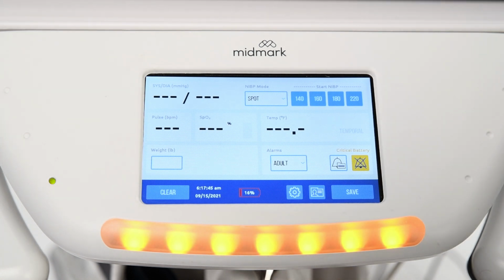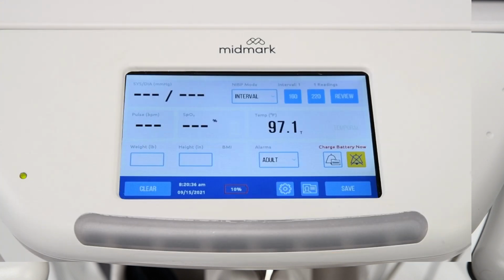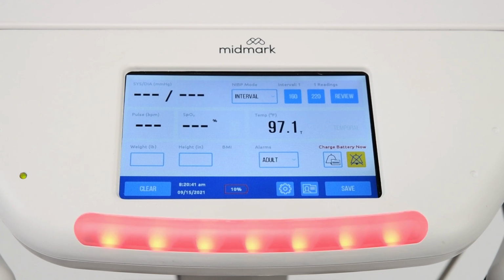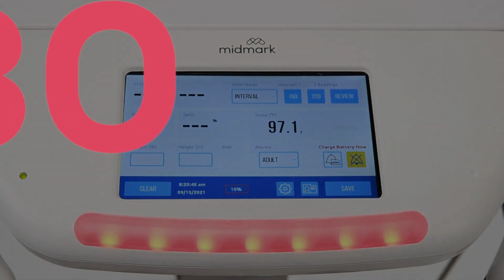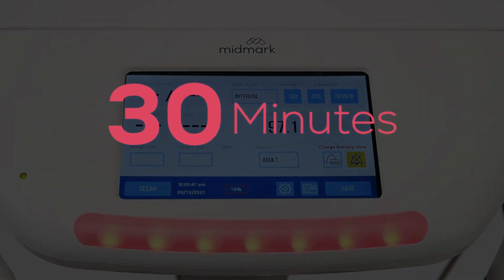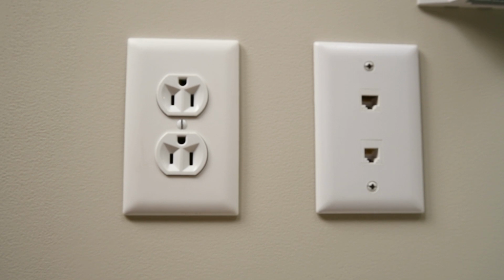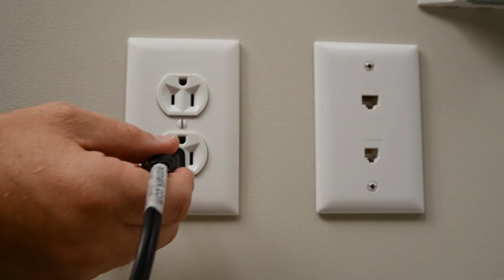When the battery reaches 10% remaining power, the device will issue a high-level alarm, and the battery icon outline will turn red. At this point, the device may have approximately 30 minutes of battery power remaining, depending on usage. You will need to connect the device to a wall outlet to recharge the battery.